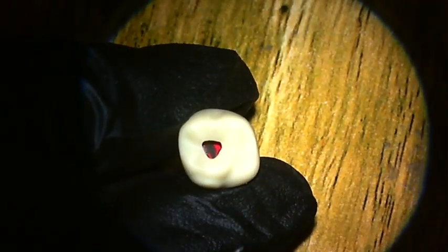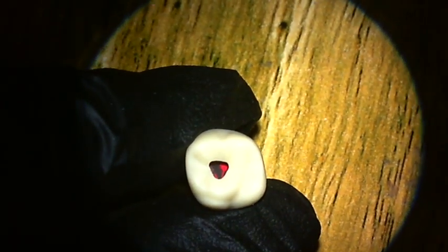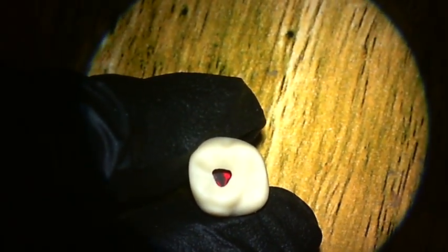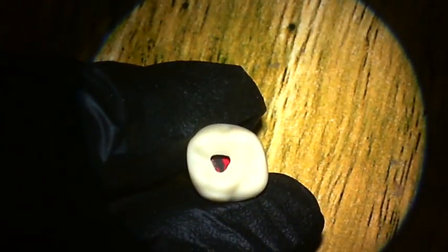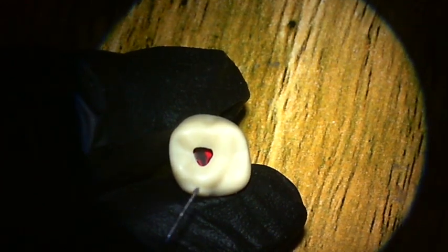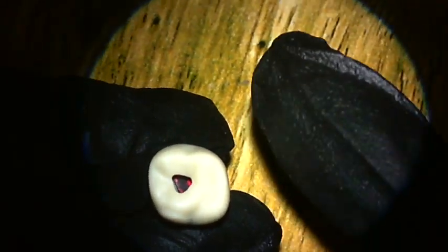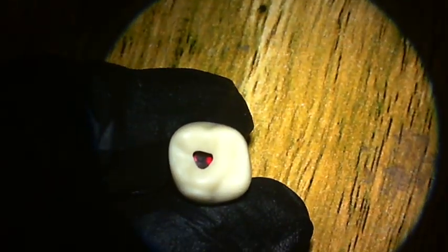ideally, when you're looking into your access cavity from occlusal view, you shouldn't be able to see all orifices all at once from a single view. So maybe you would see the distal one fully or half of each of those 3 canals. If you want to access the palatal, you had to tilt the mirror more to the buccal to see it, and if you had to see the full mesiobuccal, you had to tilt the mirror buccally and palatally and distally. That's how you know you have a conservative outline.